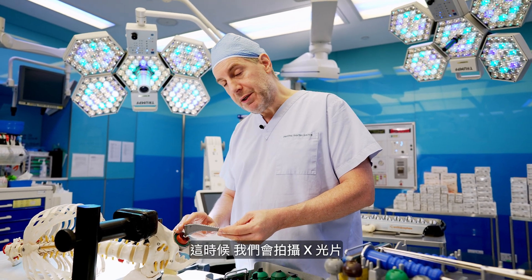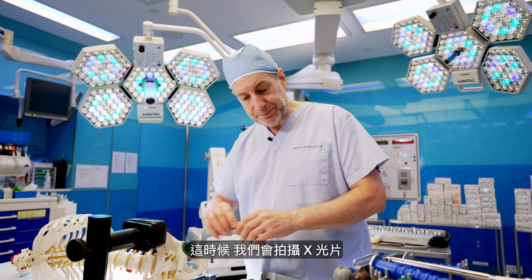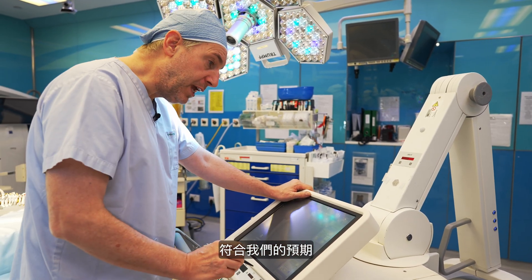At this point, we take an X-ray during the operation. The X-ray allows us to check the size and the position of the implants is as intended.